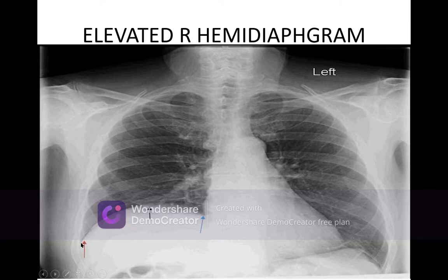Less than 300 ml is difficult to diagnose, or rather at 150 ml you can detect some obliteration. Below that, between 50 to 100 ml, you can diagnose by ultrasonography. Less than 50 ml you cannot diagnose. Only one thing can be done: aspiration will confirm it, or your clinical examination can confirm it. Otherwise it cannot. Or HRCT can be done to rule out a very small effusion.